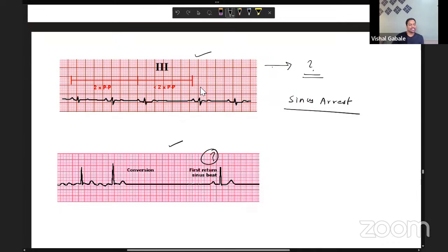As you can see, these are waves of atrial flutter. Okay, and these are typically seen. These are all waves of atrial flutter basically. And after that, conversion will occur and it looks completely normal. So there is sick sinus syndrome. That means there is a problem in the sinus nodes. And because of that, your rhythm is changing regularly.